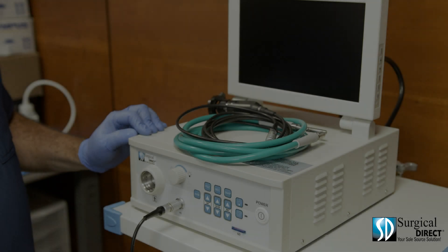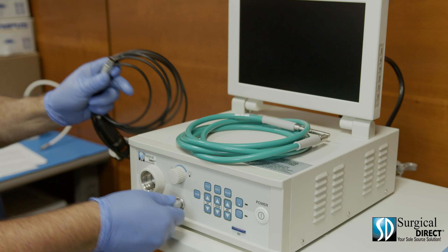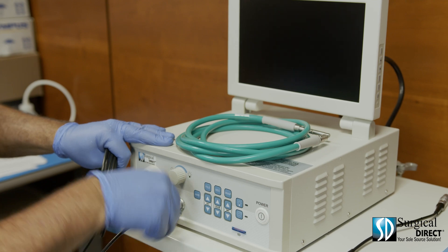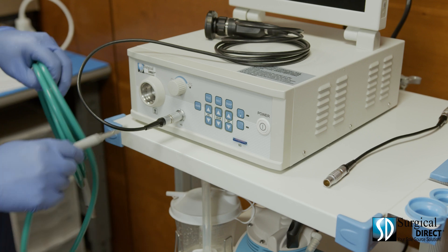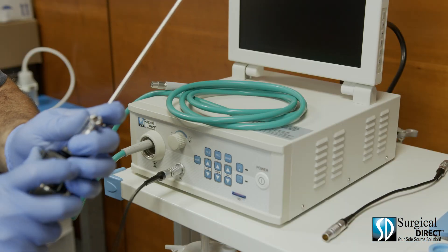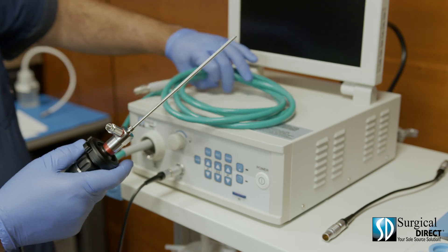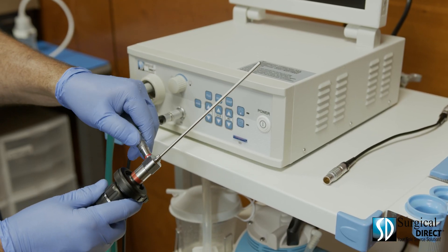Now we'll set the endoscopy system up for rigid endoscopy. Start by removing the video signal cable. With the red dot up, attach the camera to the processor. Then insert the male end of the fiber light cable into the processor. Attach the rigid scope to the camera head — be sure that it is seated properly before you let go. Next, screw in the fiber light cable to the light post on the scope.